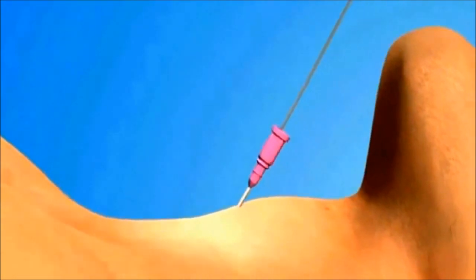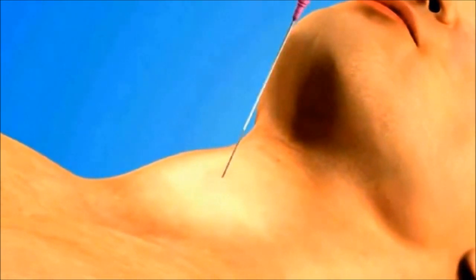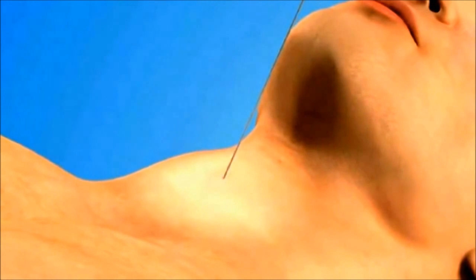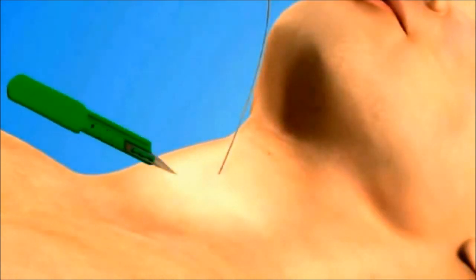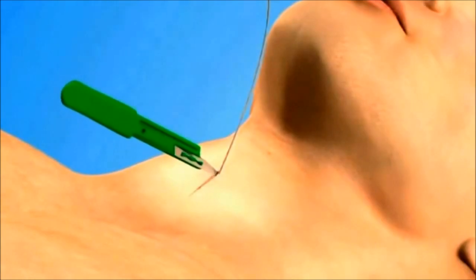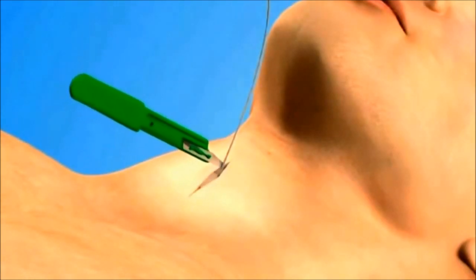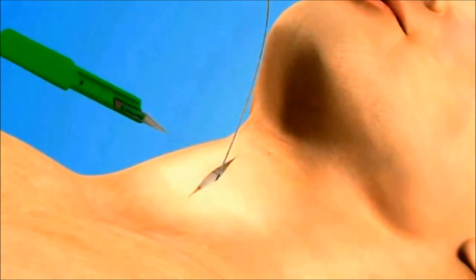While maintaining firm control of the guide wire, gently remove the catheter. Use the 11-blade scalpel to make a vertical incision in the skin over the cricothyroid membrane to facilitate passage of the dilator and airway catheter.